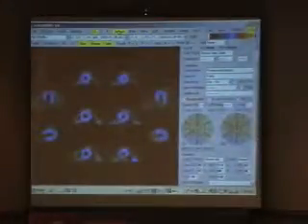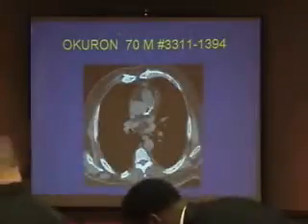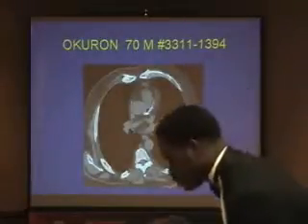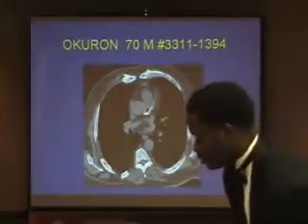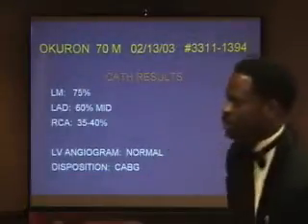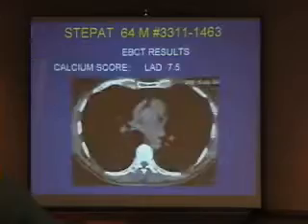And we said, well, let's send him to the Eisner study. Let's get him a free coronary calcium scan. And the result was a coronary calcium score of 1,300 and dense calcification in the left main and LAD. And now in this diabetic patient who has subtle abnormalities in the territory of the left main, including wall motion abnormalities, he goes to the cath lab where he's found to have a 75% left main stenosis, and he had bypass surgery. Now, all this not perfect.